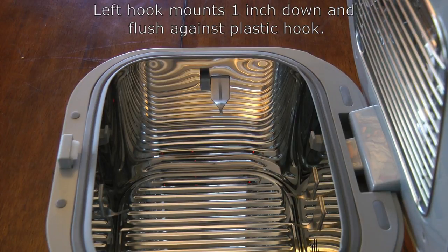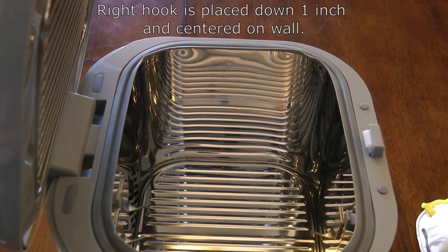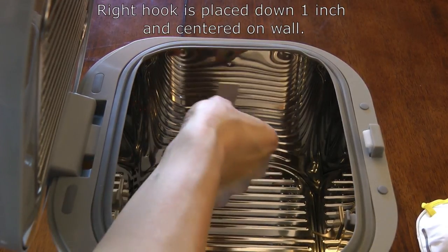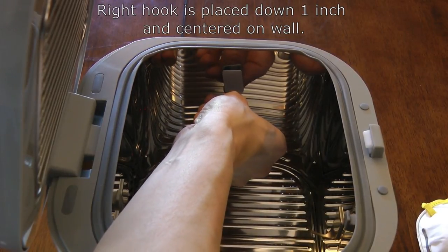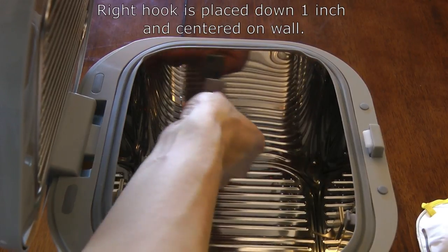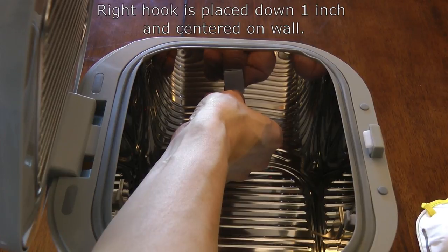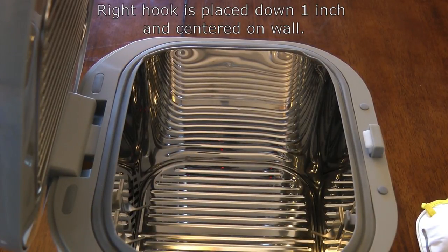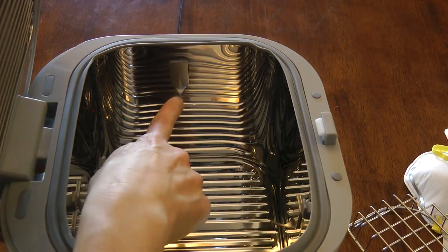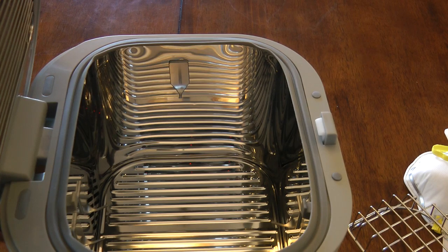The right side is quite easy. Take a hook, place it centered along the right wall, and go down one inch from the top of the chamber. It doesn't have to be perfectly centered — just eyeball it. I've gone ahead and mounted it: it's down one inch and roughly centered along the right wall.